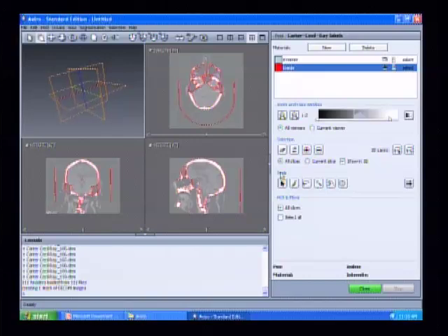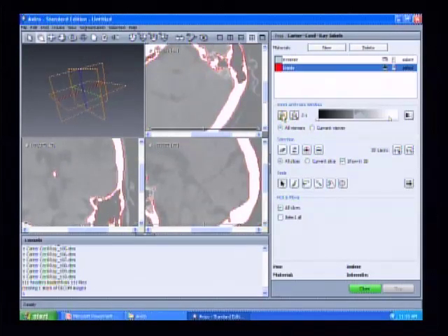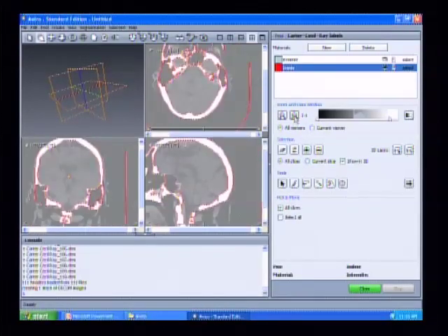So if you select your pointer tool, just your arrow from this toolbox, and zoom in a little bit, I zoomed in twice, maybe 3 times, or maybe just 1 time would be better, to about when you're in this area.